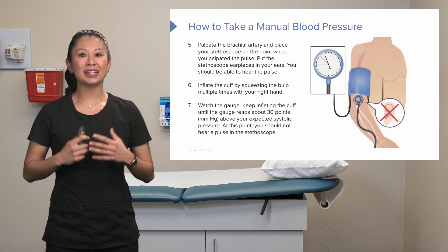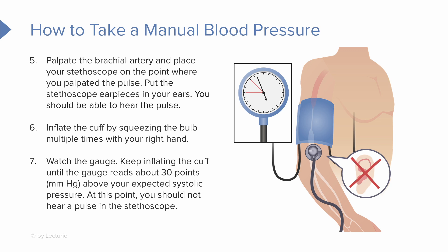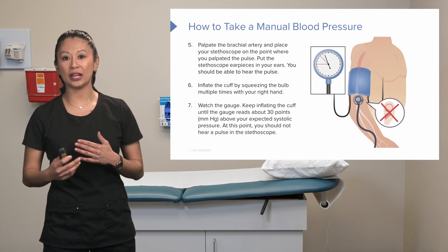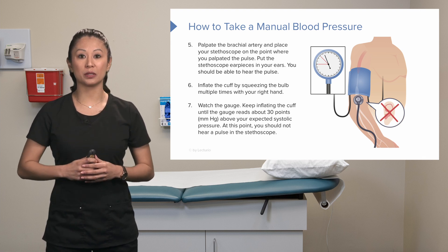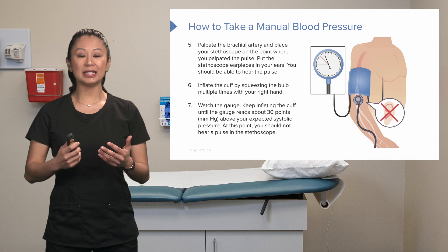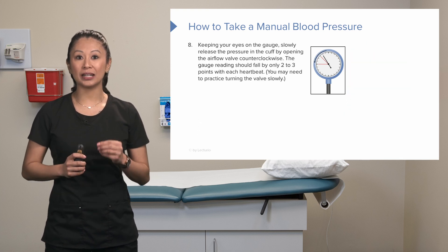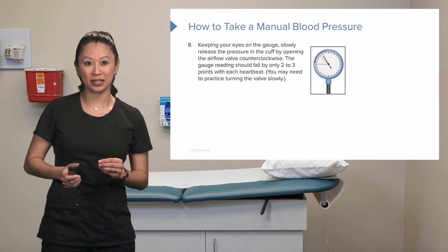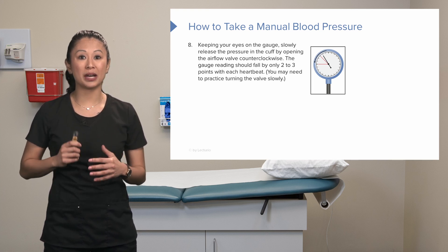Pick up the bulb and inflate the cuff by squeezing it multiple times with your hand — whichever hand is more comfortable. Keep inflating until the gauge reads about 30 millimeters of mercury above the patient's expected systolic blood pressure. It helps to ask your patient about their general blood pressure trend beforehand. Once inflated, you should not hear any pulse in the stethoscope. Then slowly and smoothly release the pressure by opening the airflow valve counterclockwise, and the gauge should fall only about two to three points with each heartbeat.